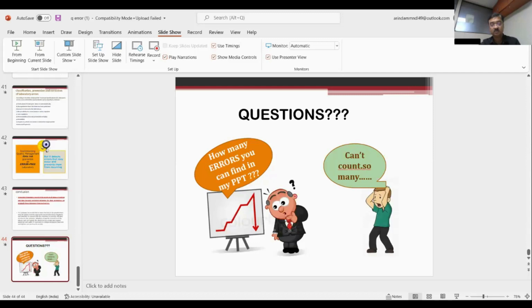In the last case we missed out the error, there was some network issue, okay? So the last error is the storage. I told you, no? Haemophilus influenzae is thermosensitive. So the person has stored it in a refrigerator. That led to the death of all the Haemophilus influenzae. So the next time, the culture shows no growth.